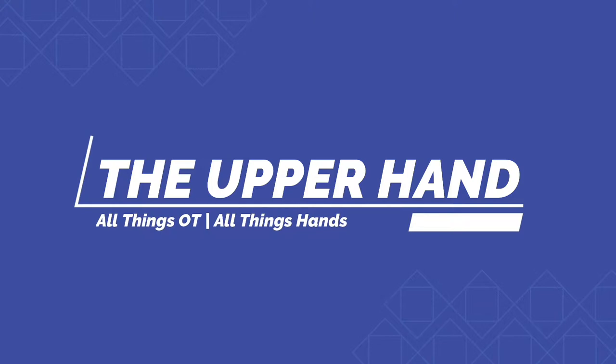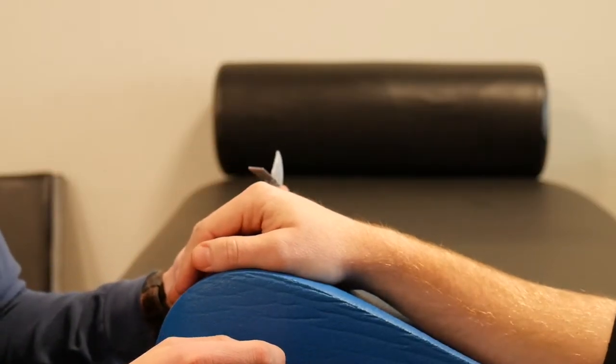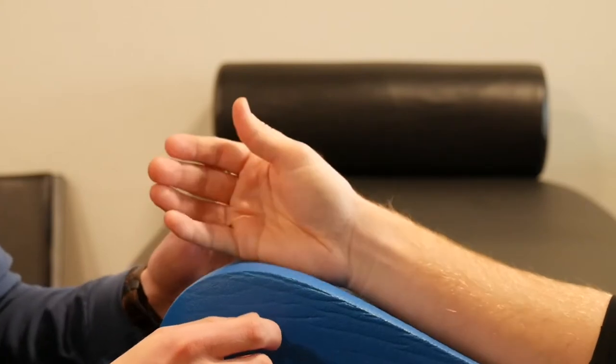So today the range of motion video will be all about the thumb. We're going to start with the MP joint of the thumb, or MCP joint of the thumb, however you denote that.